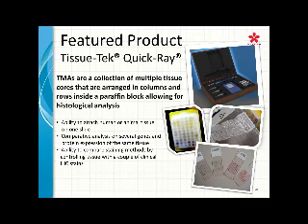So really you're going to perform them just like you would perform other immunohistochemistry stains, but running a known control with your tissue that you know works very well for this antibody is really, really important no matter what type of tissue, what type of fixation. That way that's your gauge to say, yes, it's working, or no, it's not.